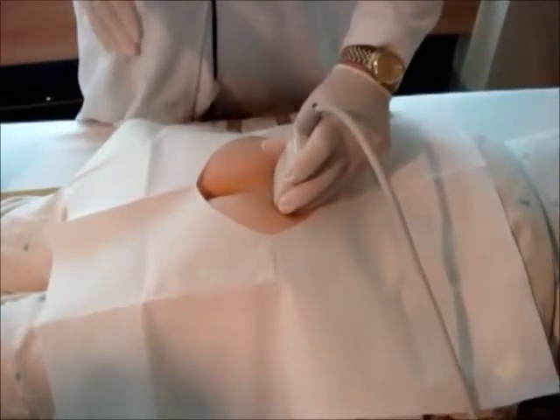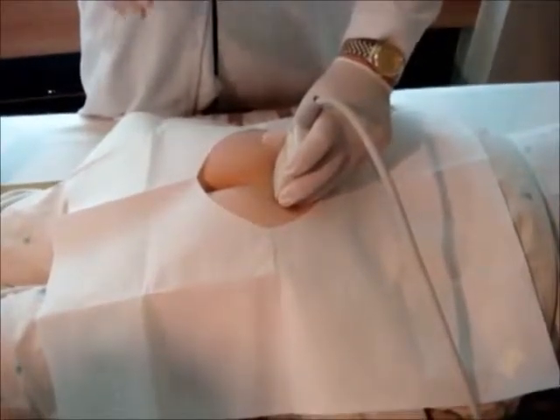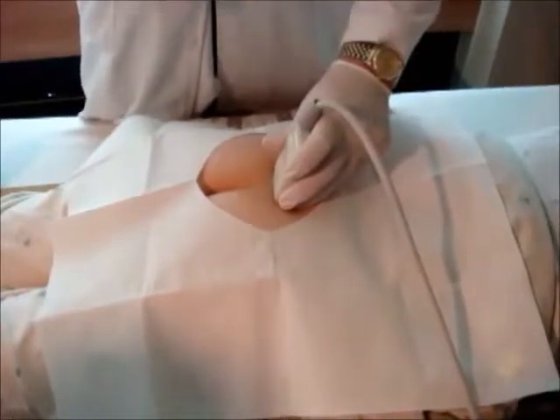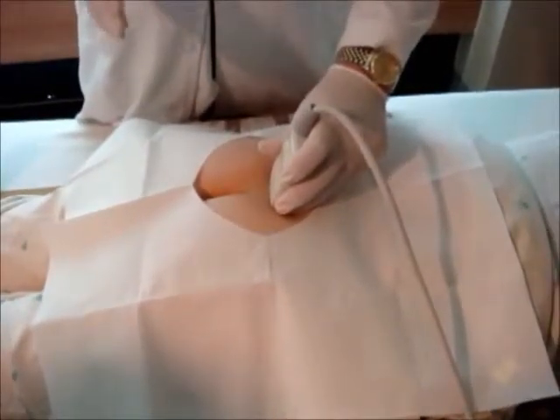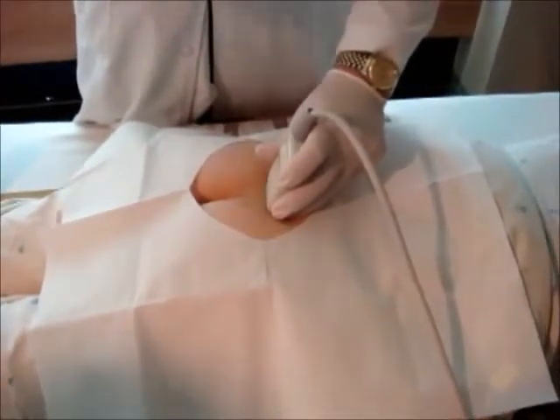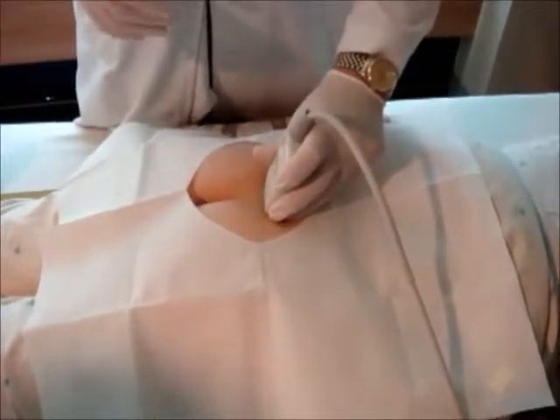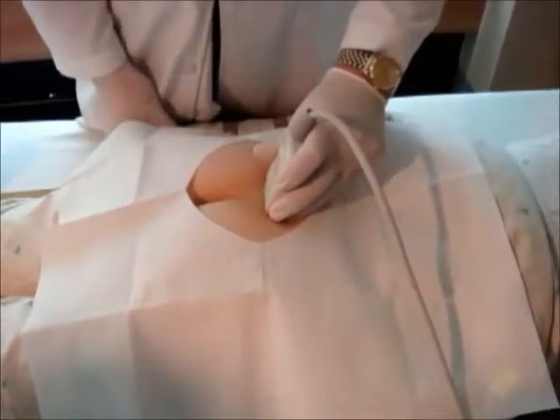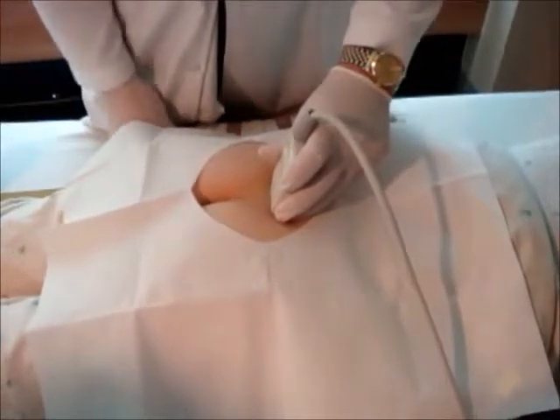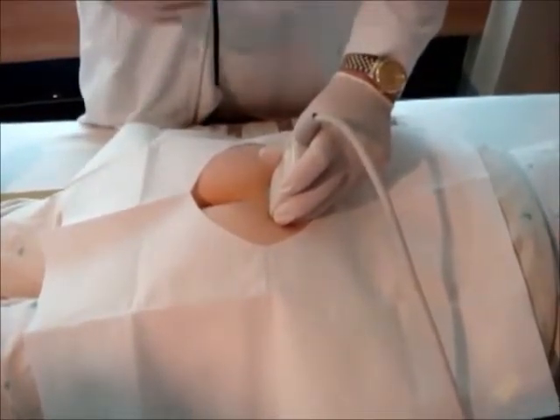We will now start our caudal epidural injection using ultrasound guidance. The patient is placed in the prone position. Pillows or additional towels can be placed underneath to increase the pelvic tilt.